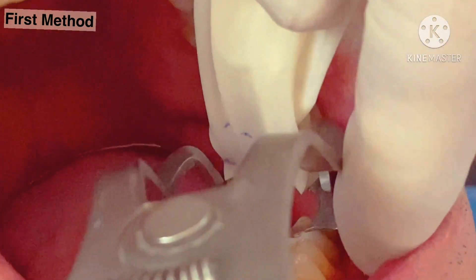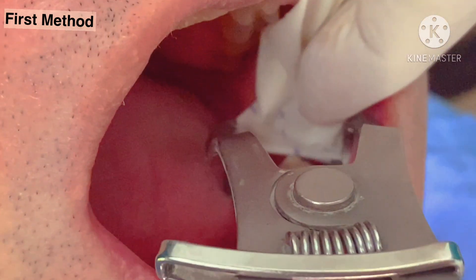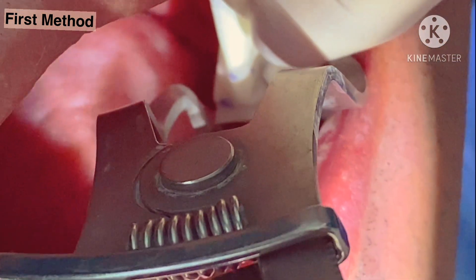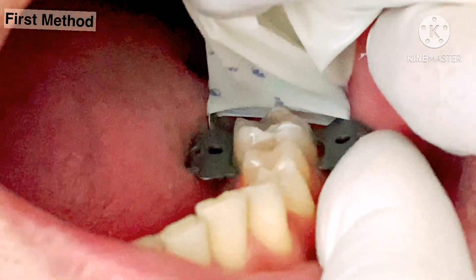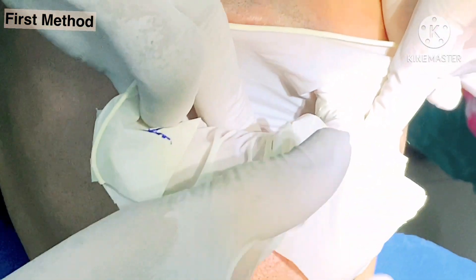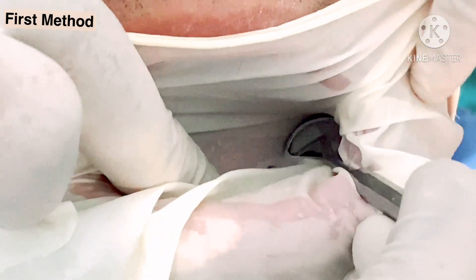Now just see how I am going to do it. All the teeth are visible. The patient has not been anesthetized, so I have to see that I am not pinching the gum, and then slowly I leave it. I have placed the clamp on tooth 3-6. Please hold it. Now I take it — light curve — and I just slip it around the clamp.